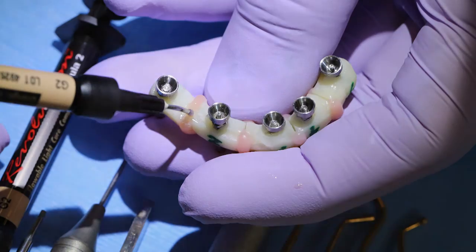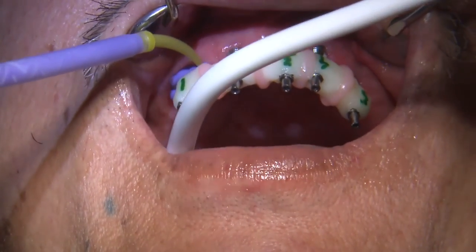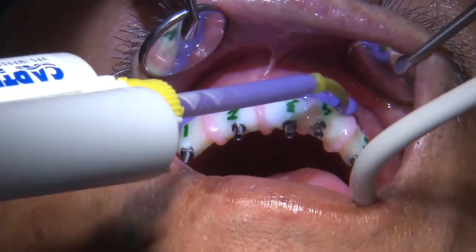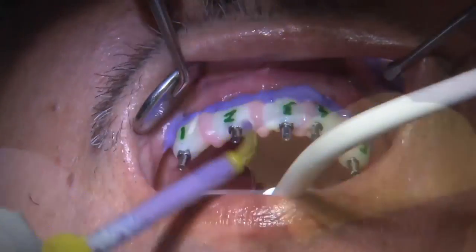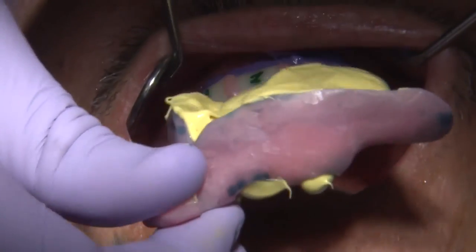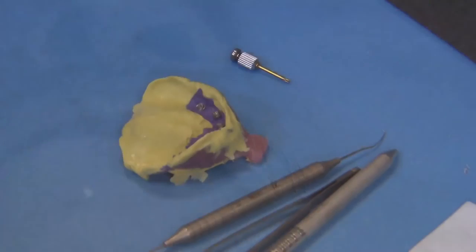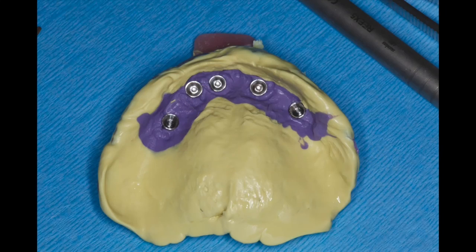We're using Capture impression material — medium body to capture the tissue surface, and heavy body to pick everything up with the open tray impression technique. Once the material is set, I remove the jig and the impression all in one, so the jig is embedded in the impression. We now have a final impression to fabricate a verified working cast, which is critical for the fabrication of final restorations that seat passively and tension-free.